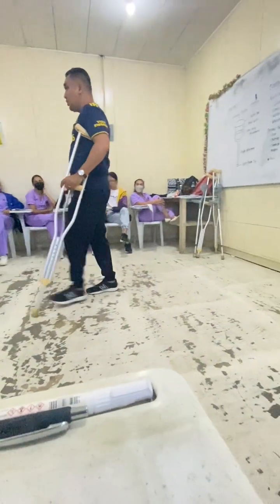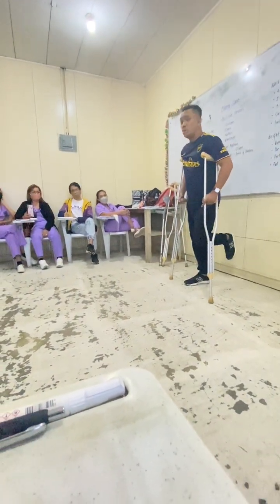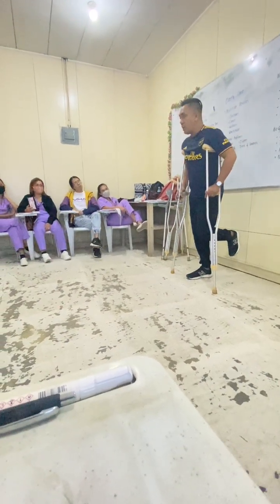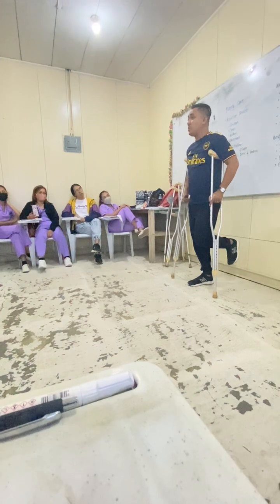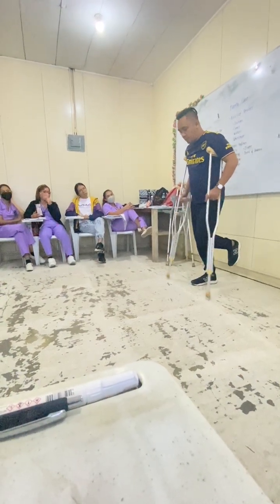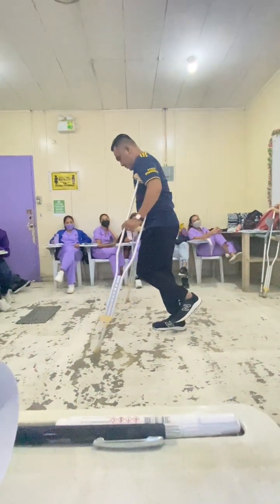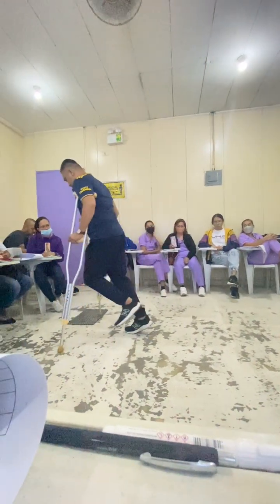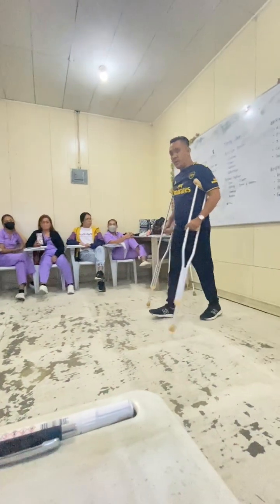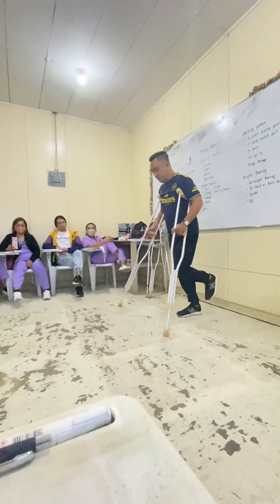If the patient is using 3-point crutch gait, pwede po siya mo gamit sa swing to o swing through. If the patient is pag-ula siya nakakat-on o how to kanyang auxiliary crutch, to swing to sa to itudlo niya. Which means that the good leg should level sa crutch tips. Mas easy ang work. Because bago po siya nag-learn. Okay? Now, if the patient is already familiar with the walking pattern, then mag-swing through na siya na 3-point. Lapas na.